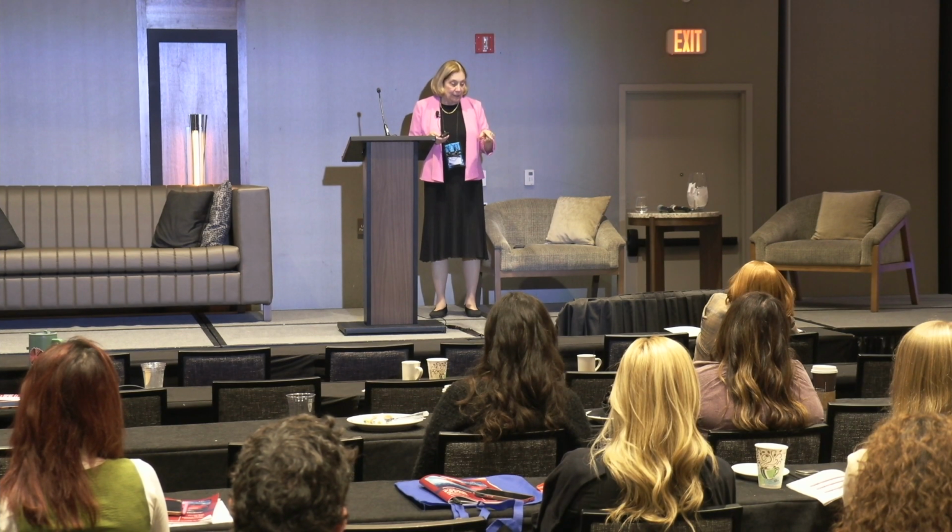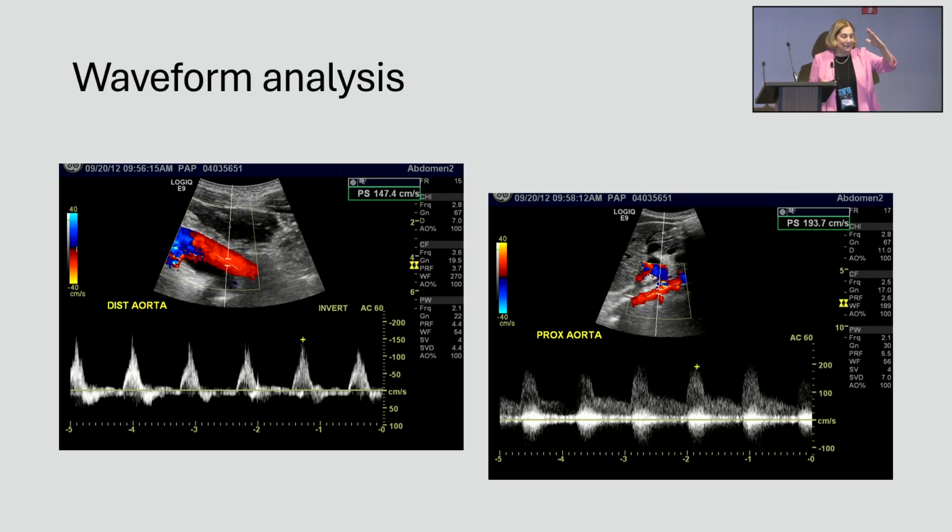In the distal one, you've got a little bit of delayed upstroke, which isn't really very obvious here. Sometimes your ears will tell you. Do not turn the sound off and do an ultrasound and duplex. Please don't. Keep your sound on.